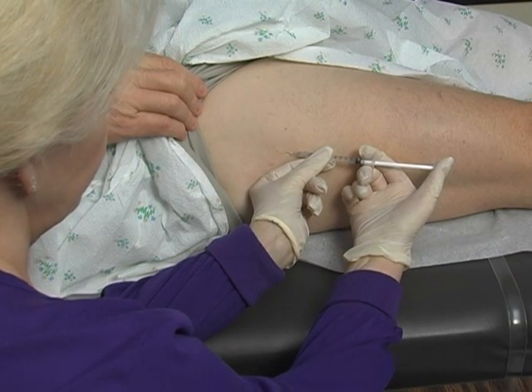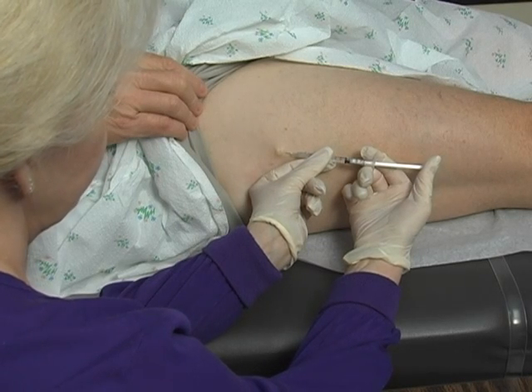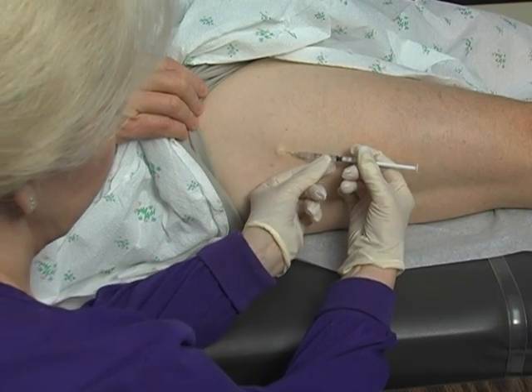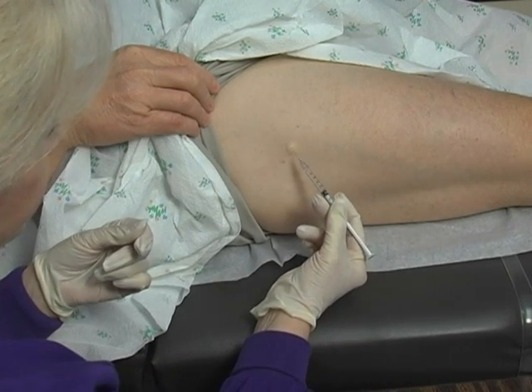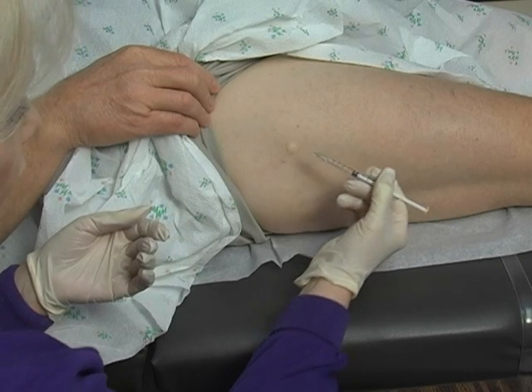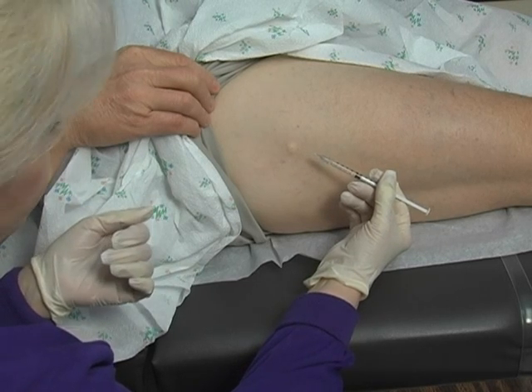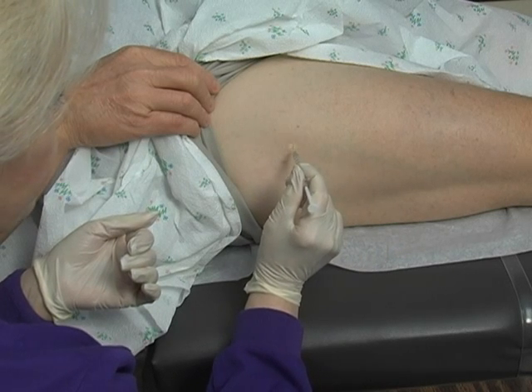What you're watching for is a nice little bleb to develop. Typically we fill up our syringes to about 0.7 cc's, though you only need 0.4 to 0.5 cc's. This is the area that will take our biopsy. You want to be careful not to use the area where the tract is from injecting the lidocaine. If you're concerned about whether the patient is numb, you can give them a test.